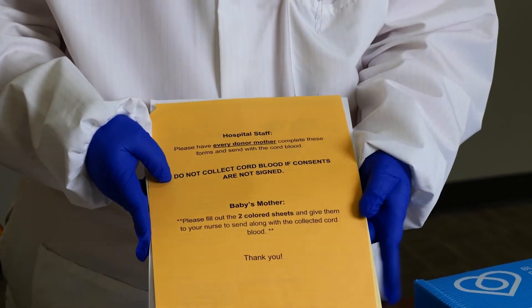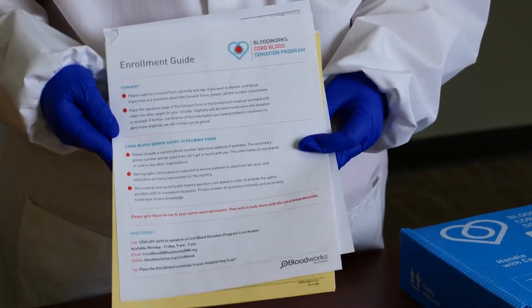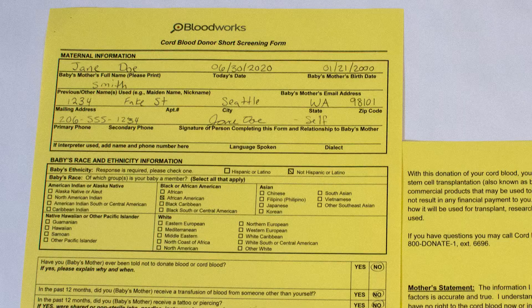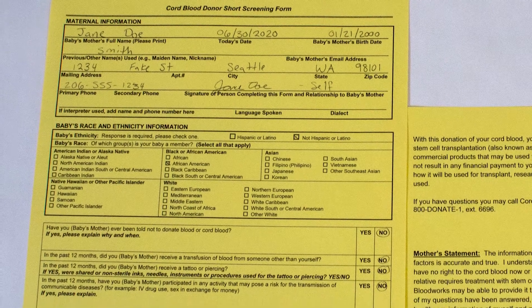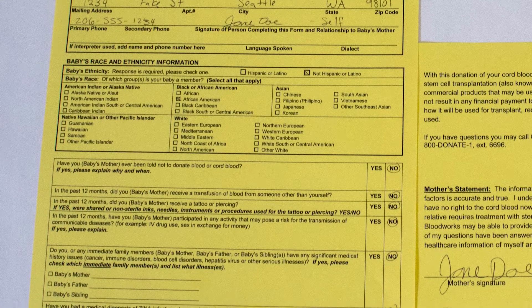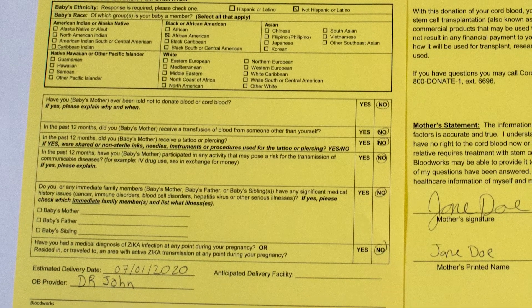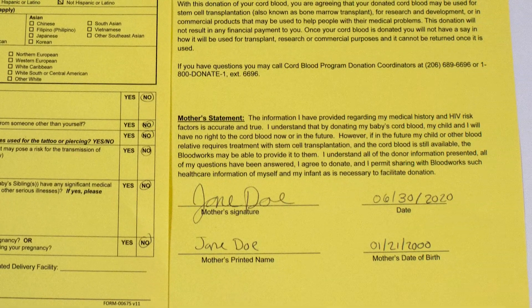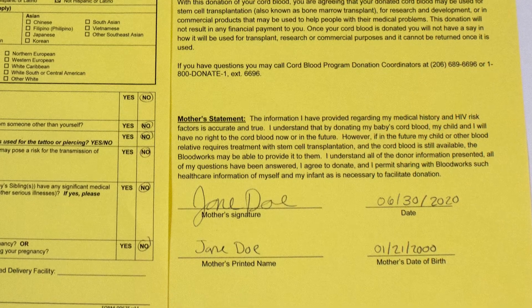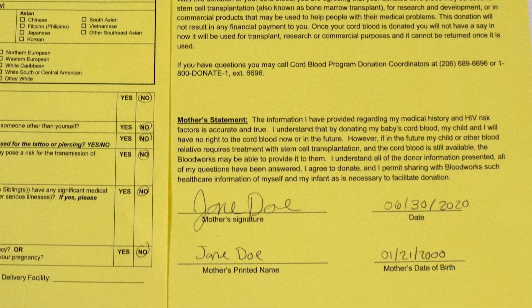These instructions include both vaginal and cesarean deliveries. The next forms in the packet are for the patients. This includes information about Cord Blood Collection and what the patient will need to fill out — a short screening form with their demographics, address, and anything that might make them ineligible for donating cord blood, such as travel restrictions or family medical history. The patient will also need to fill out a consent form, signed prior to the Cord Blood Collection.